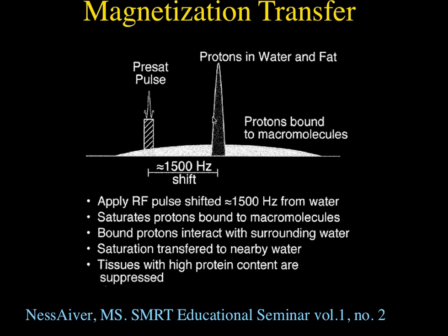So it was found a long time ago in biochemistry that if you put in a saturation pulse, so that you take the Z component of the bulk magnetization vector in this area of the water to zero, then if you saturated the spins here and then did a spin echo, you would end up with a lower signal intensity than if you didn't saturate the spins here, if you're imaging in this area at this frequency, which is where this water is.